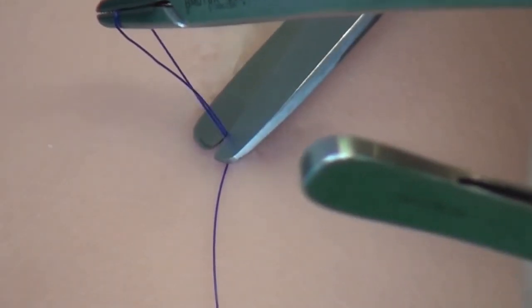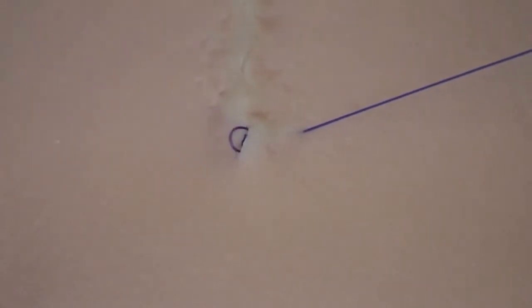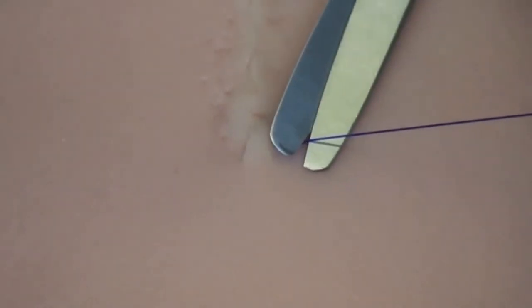The loop end is cut short. The thread is now directed above the knot and can be led through the side of the wound and out of the skin and cut very short, so that the knot is more easily buried in the tissue.